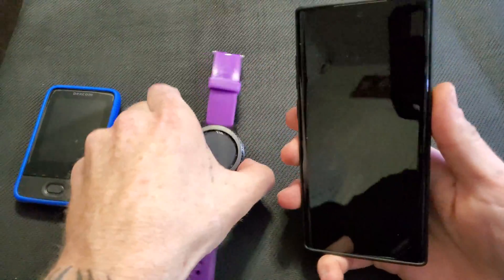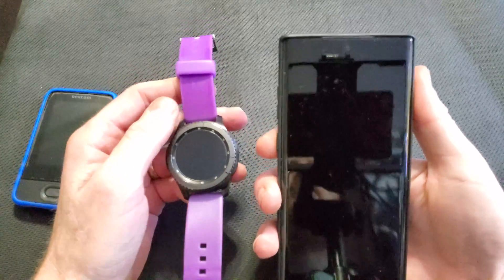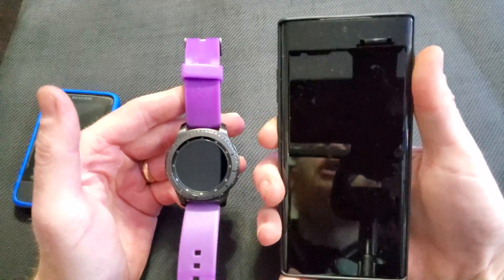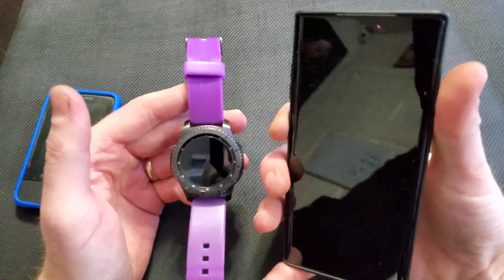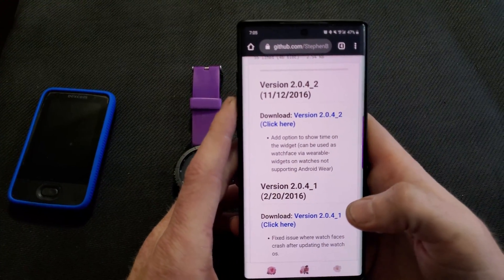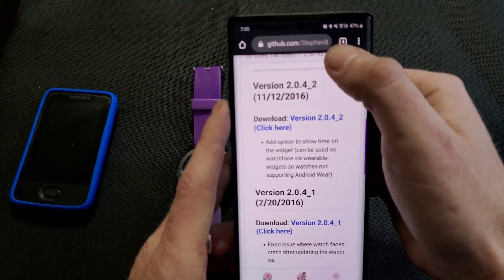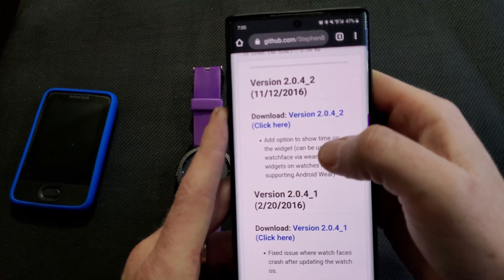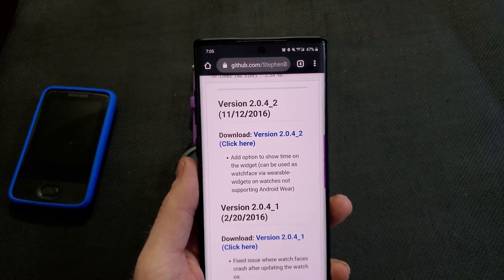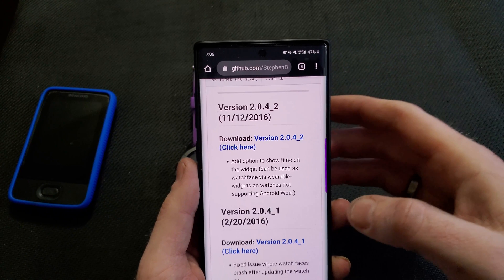Alright, so I'm going to show you this on my wife's phone. Since I've already had this installed on my phone, it's just pulling up all my old info, and I want to show you exactly how this works. I'll have this link posted on the screen and also try to post it down below. This link does need to be entered exactly as shown, with the capital letters and everything.